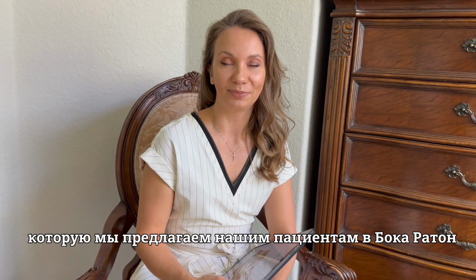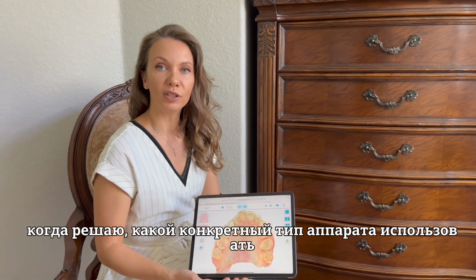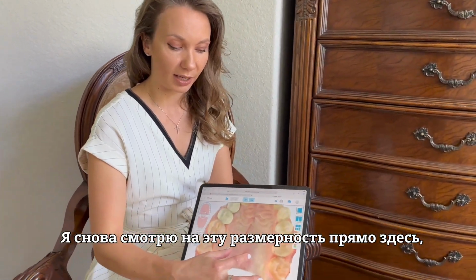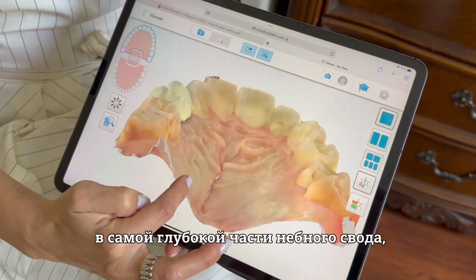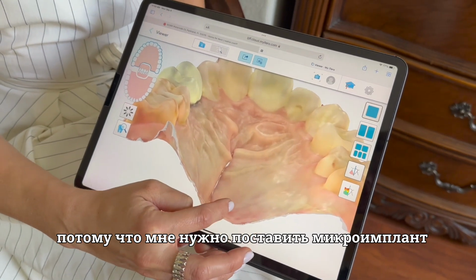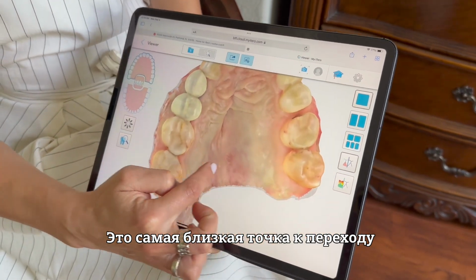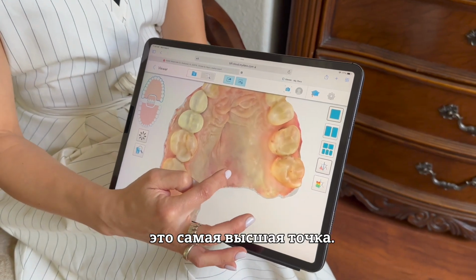What am I looking for when I decide on a specific type of appliance during our consultation with the patient? First of all, I'm looking again at this dimension right here in the deepest part of the palatal vault, because I have to insert my mini screws right in this position, which is the closest to the transition between the hard and soft palate. This is the highest point.